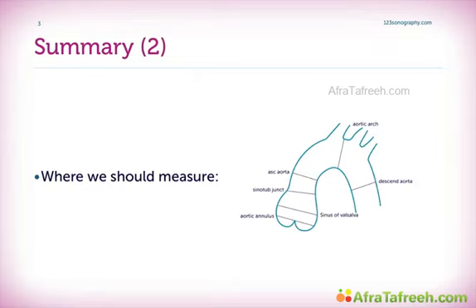We can measure the aorta at the following points to fully describe the entire morphology: the aortic annulus, the sinus of Valsalva, the sinotubular junction, the ascending aorta, the aortic arch, and, if we can visualize it, the descending aorta, at least the cranial portions.